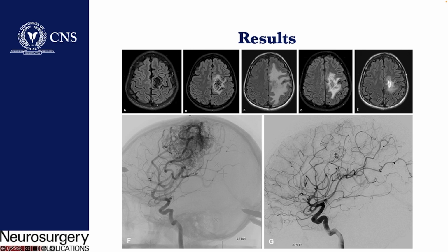This is a 13-year-old patient with an unruptured brain AVM managed with volume-staged SRS. 2 months following the second SRS, she presented with a headache and mild right leg weakness that resolved after 2 tapers of steroids. Significant reduction in the last angiogram after 43 months is seen.